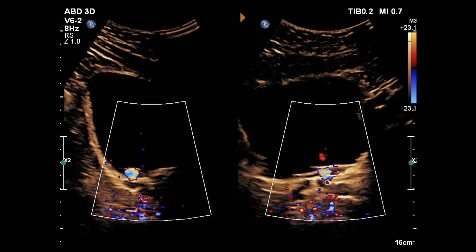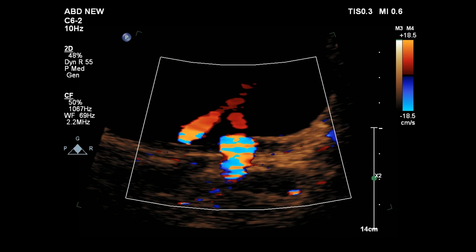Color Doppler shows a twinkling artifact on this image. You can also see bilateral bladder jets anterior to the twinkling artifact, which ensures that the left vesicoureteric junction is not completely obstructed.